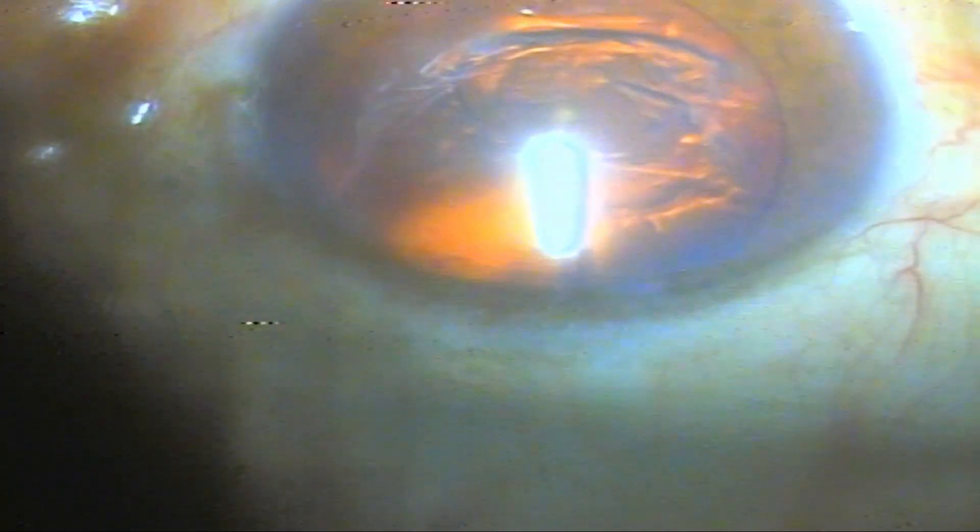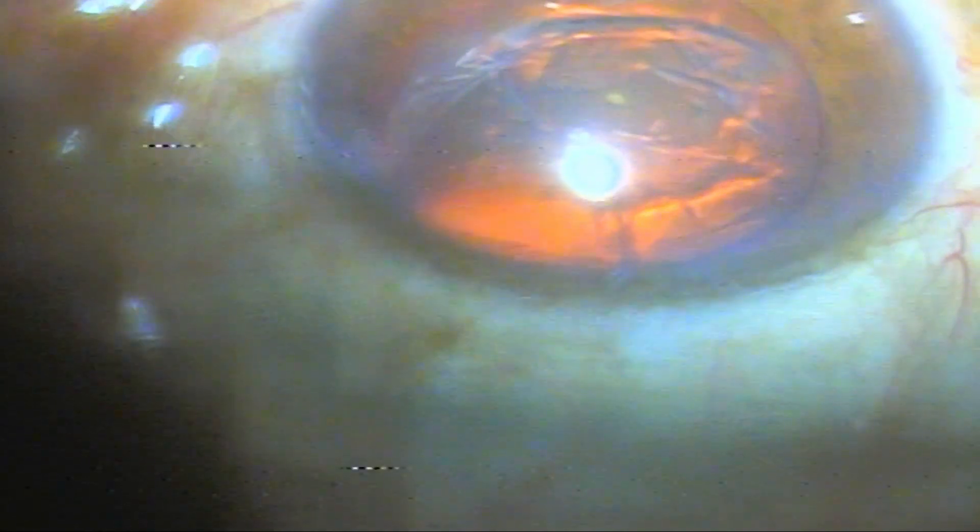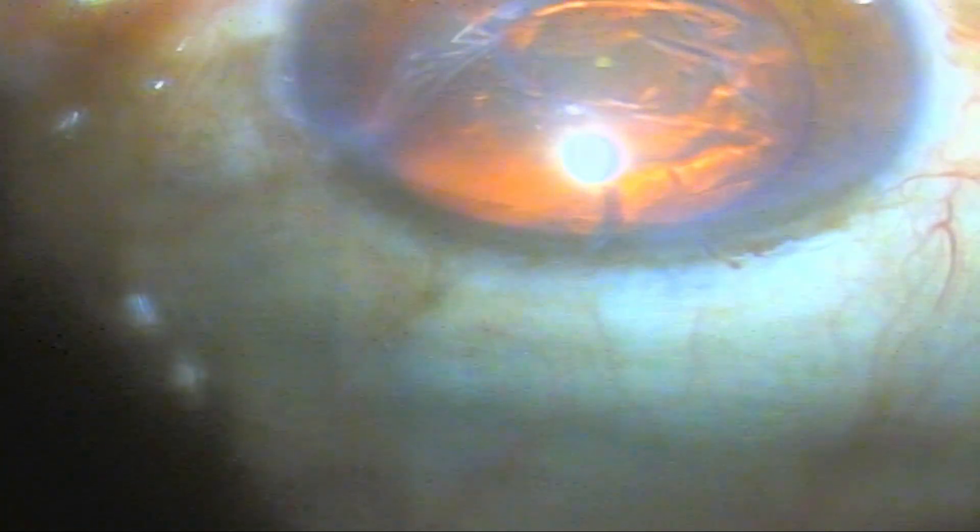Through the cystotome port, methylcellulose has been injected to build up the intraocular pressure for the clear corneal surgical limbal two-step incision with diamond knife. The diamond knife used in this case is 2.75 millimeters in diameter. In this case, I will also make two opposite side ports because the patient has astigmatism which is more at the plus side vertically.